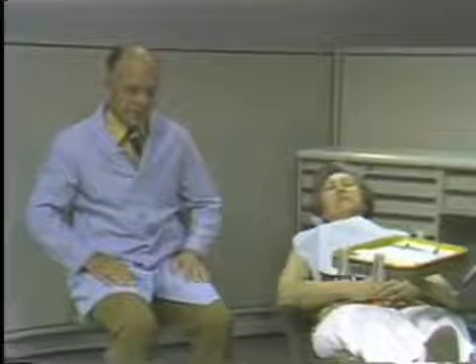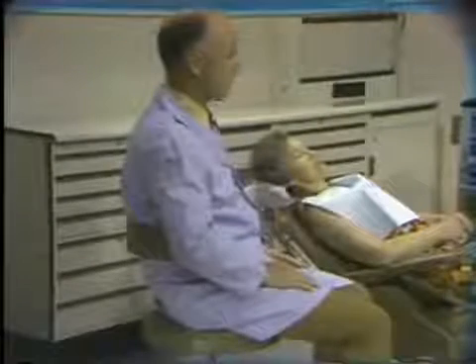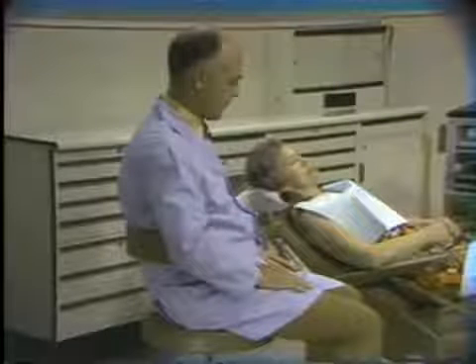This gives a little added height to the operator and enables him to see down better into the lower right quadrant. The back should be relatively straight. He will look down with his neck and eyes. Don't look over or bend over with the back. Stand up straight. Look down with your head and use the eyes.